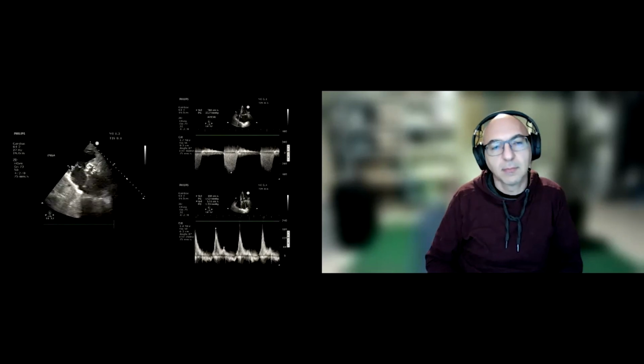This is just going to remind us of where we've been today. We have a patient with severe AS who's got, I didn't put an LV function picture in here, but a decently normal LV function, but we have some diastolic dysfunction, right? And we have some pulmonary hypertension that we see reflected through our right-sided measurements. And that's kind of the scenario we've got.